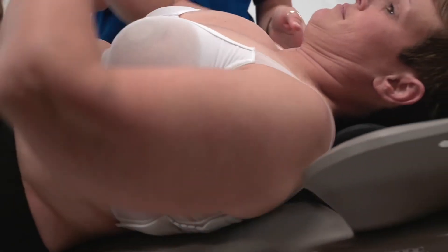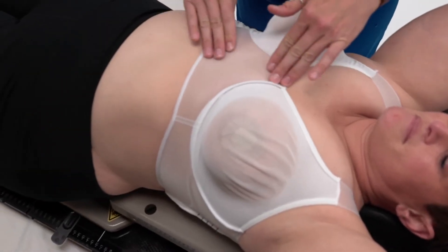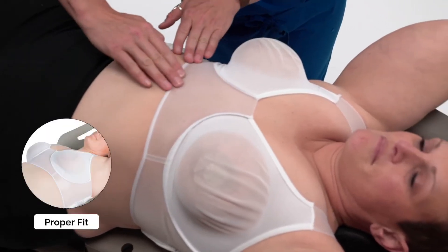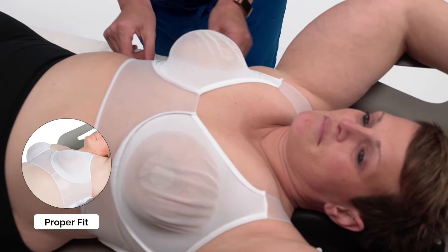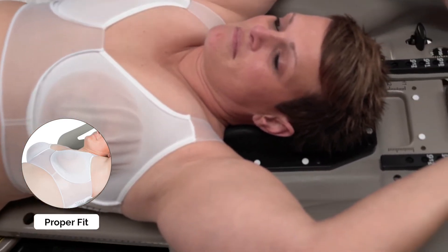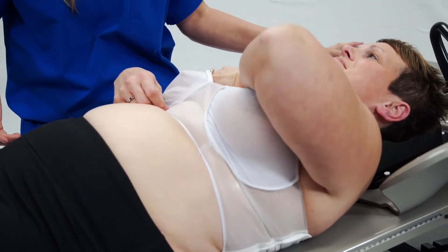Have your patient lie down in the treatment position. Readjust the bra to make sure that the clear plastic portion is flush against their skin. The sheer elastic breast cup should be flush against the skin also, but this may not always happen. If your patient is able, you may need to have her adjust herself in the cup and have her sit up a few times to ensure the bra fits properly.